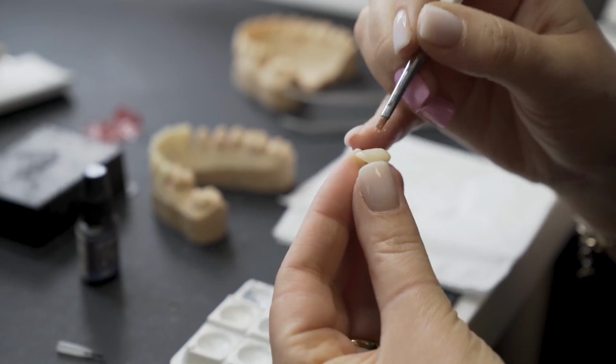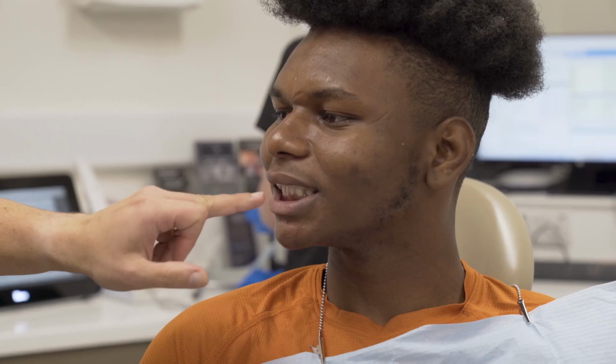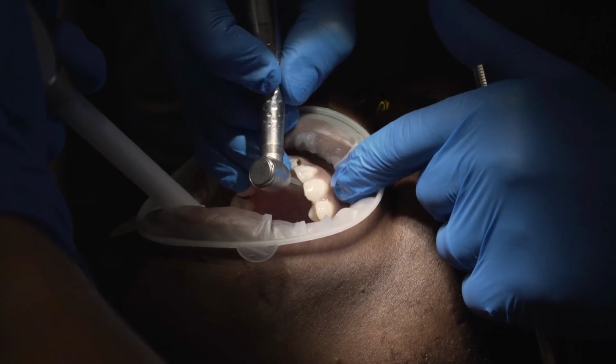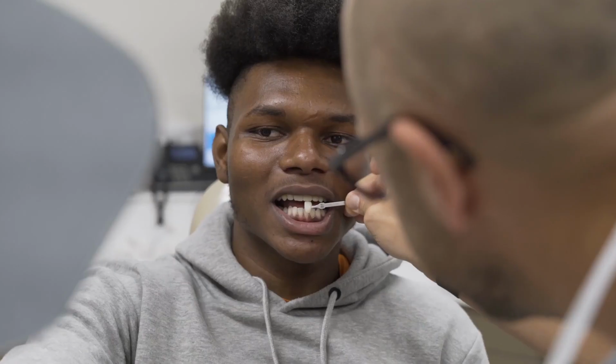Hey there. So when it comes to post-processing and fitting for definitive restorations, at our practice we find it more controlled if we print the model as well and get everything finished on that model. And we've got enough time in today's case to do that. The patient's coming in first thing, and then we're fitting them last thing in the day. That means that I can obviously check the fit, check the contacts in the same way as I would do for any other definitive material. The only difference is that workflow has been compressed into a single clinical day.